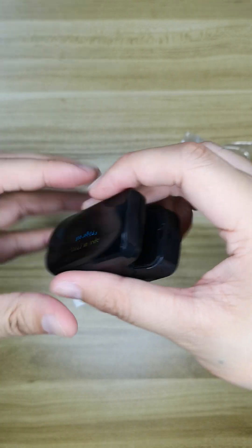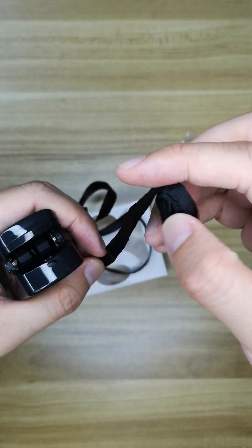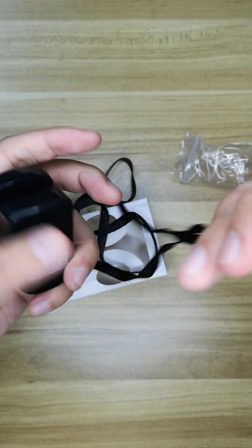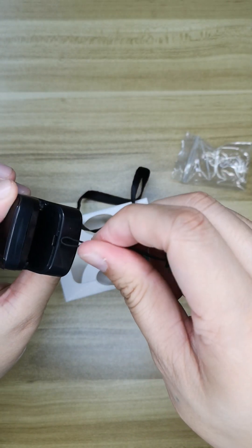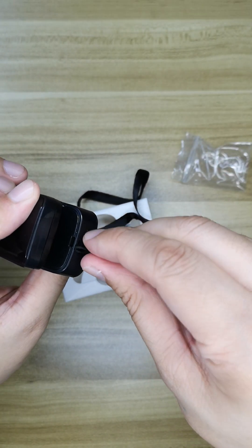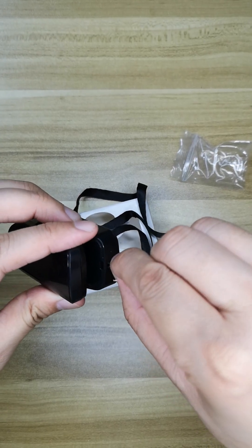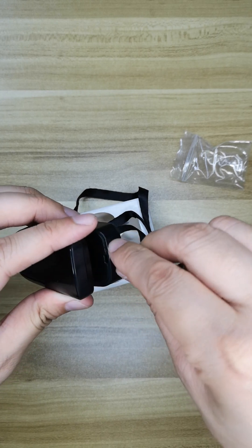If you want to know what the strap can do, here's how to attach it — you go in here, and then you can make it portable.